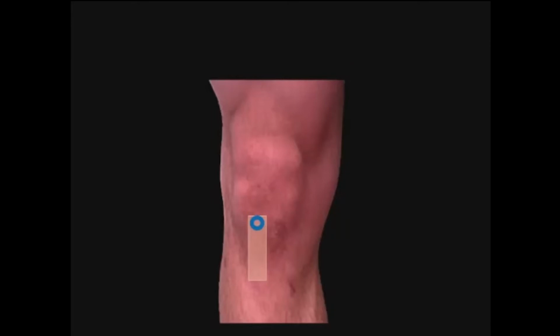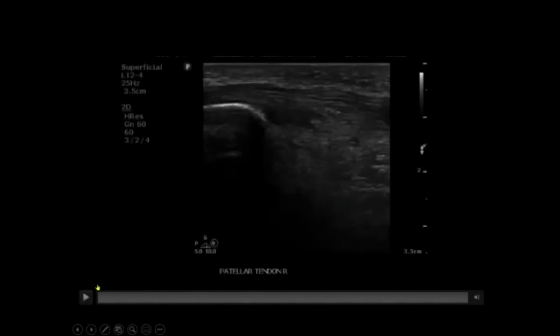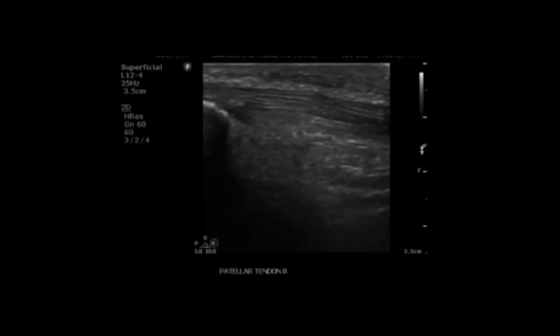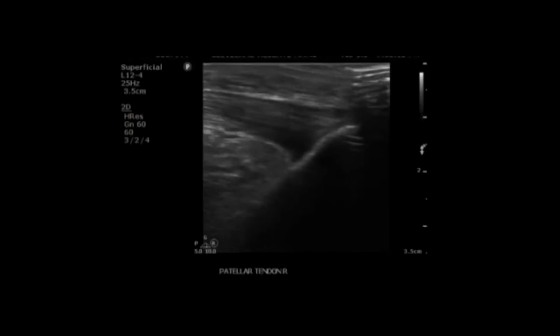This is a patient who's got knee pain, particularly they were lifting weights, and they've got knee pain, particularly anterior and right in the patellar tendon. So the thought is, oh, maybe they have a patellar tendon tear. So as we look at this first in the sagittal, and the kneecap is right here. So patella is there, and the tendon, patellar tendon going down to the tuberosity is there. And you can see that there's actually a little bit of tear just inferior to the patella.